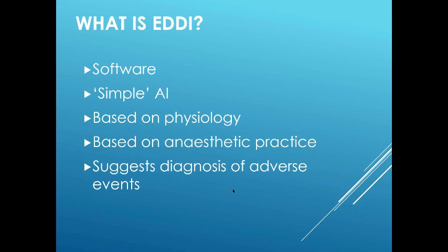The algorithms are based on well-established physiological knowledge combined with the changes that take place during anaesthesia, for example, changes in respiratory gases when the lungs are ventilated. It can modify some outputs if the anaesthetic is totally intravenous or regional. The software suggests diagnoses or provides a warning. It does not suggest treatment. That is solely in the hands of the clinician.